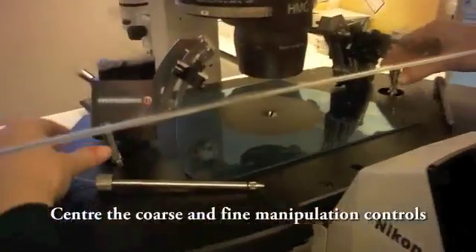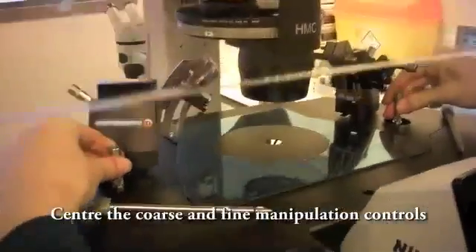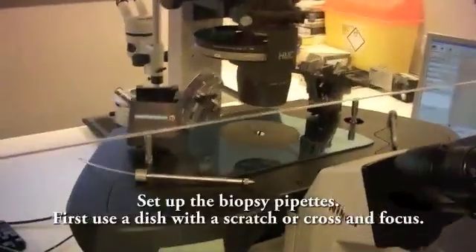Centre the coarse and fine manipulation controls. Set up the biopsy pipettes.